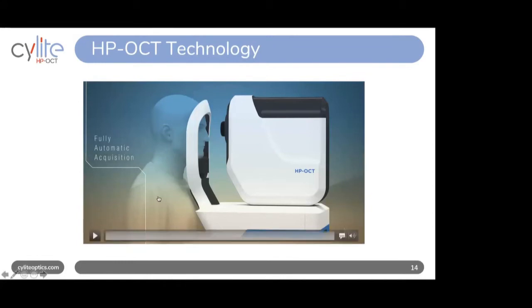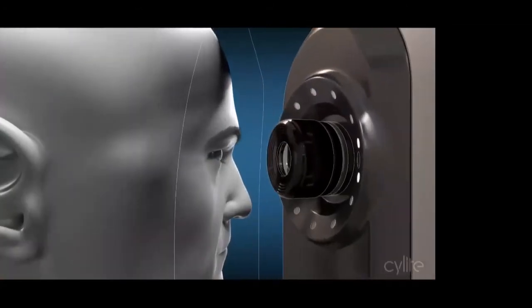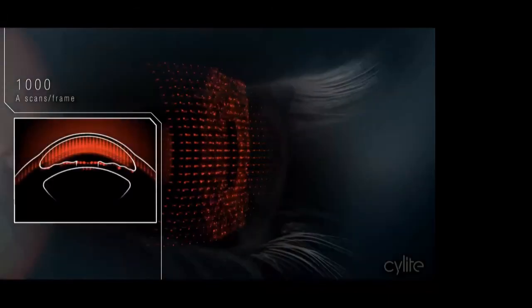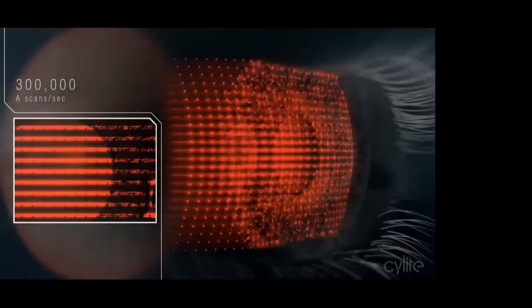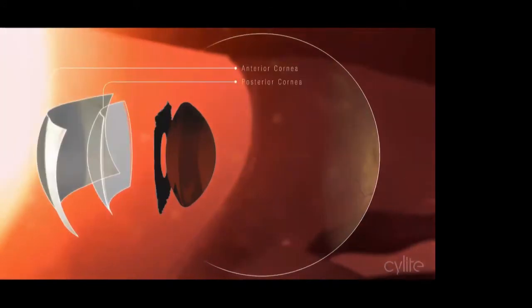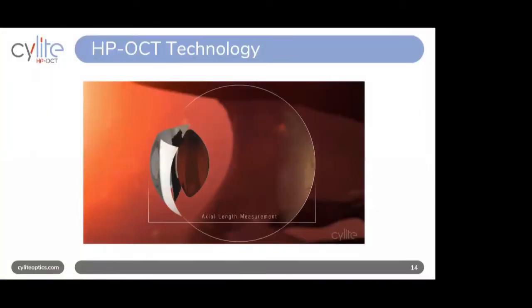What we'll see here is a little video which is going to show how the system works in practice. So we'll just start that up, and we have an automatic alignment of the system with the patient. It finds the eye. Built into there is a whole bunch of cameras to automatically align. And then we start to fire these arrays of dots at the eye. As you can see in the left-hand inset, we dither it very slightly to fill in the gaps between each of the beams, which allows us to get a very high-resolution image from which we can extrapolate all of the critical parameters that are needed to characterize the eye.